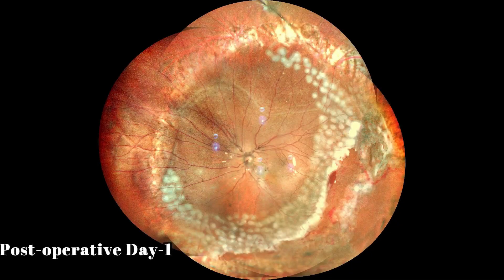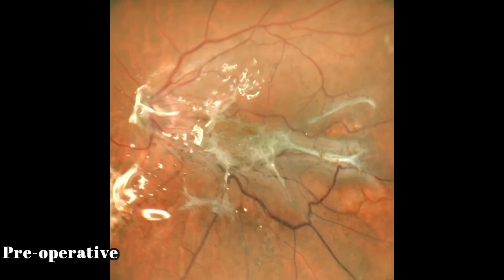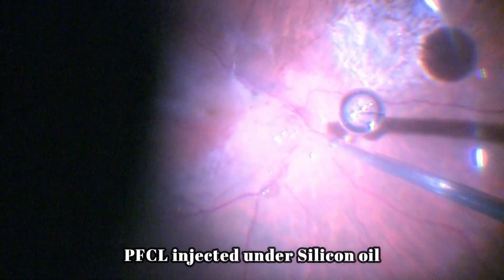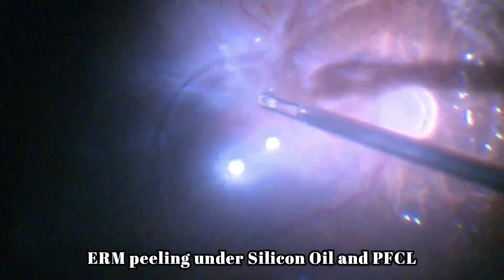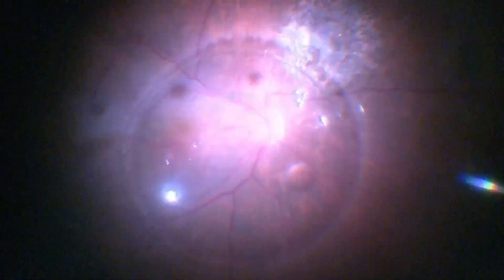This was the post-operative day one picture of this case. Next is an ERM removal under silicone oil and also under PFCL, which is injected in the retro-silicone plane. There is a space between the oil and the retina which is redundant, so to get a nice grip over the membrane, we inject PFCL in that plane and after that we remove the membrane. This helps keep the retina taut and flatten well under PFCL.